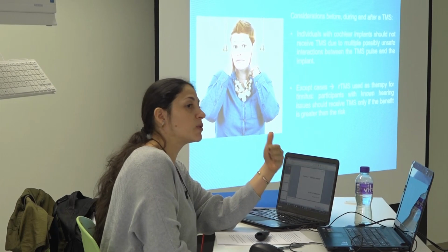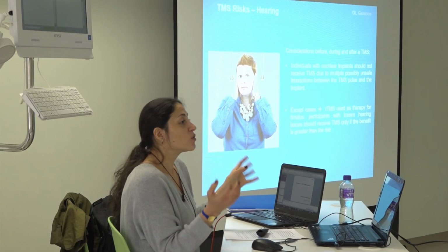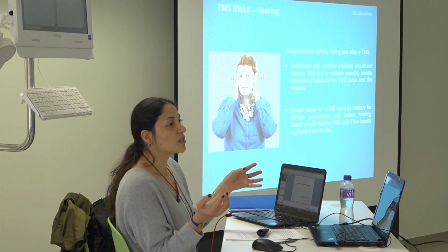Considerations before, during, and after a TMS experiment. Some individuals have cochlear implants, so they should not receive TMS. It's the same thing we talked about before with other implants. It can cause damage, or it can move or shift, or whatever. As there may be many interactions between the pulse and the equipment, an individual with a cochlear implant should not be measured. Of course, you need to consult your doctor. It's not a decision I will make.